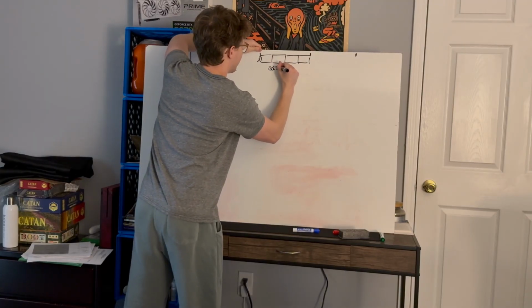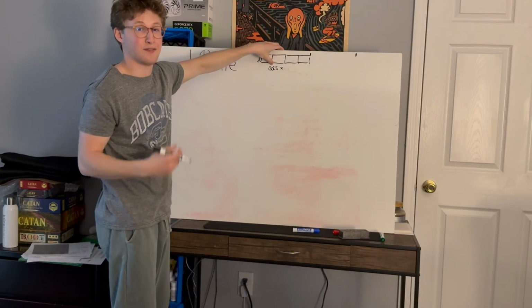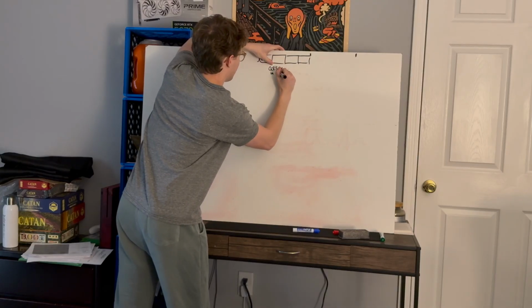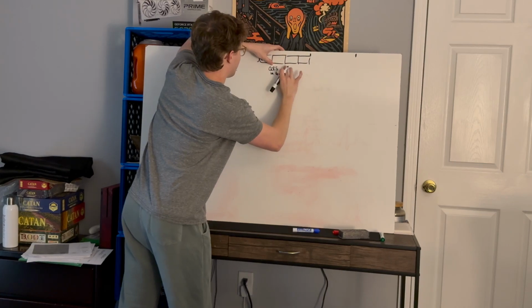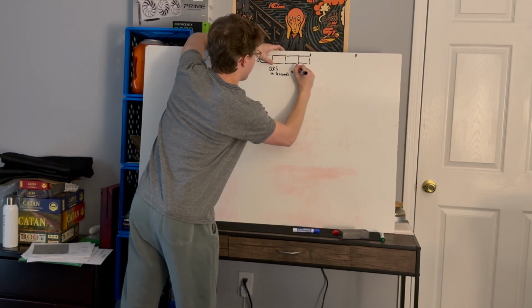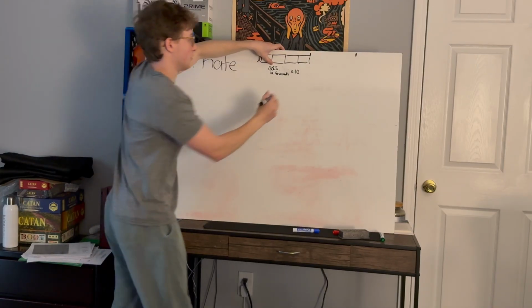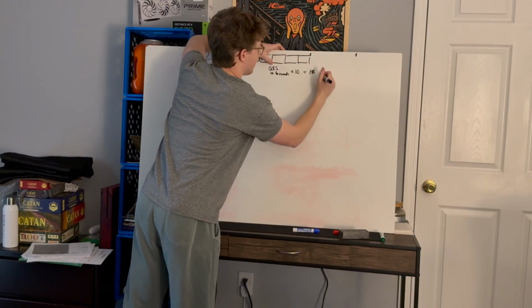So whatever number of QRS complexes you have in 6 seconds, you multiply that by 10 to get 60 seconds or 1 minute, and that equals a rough estimate of heart rate.